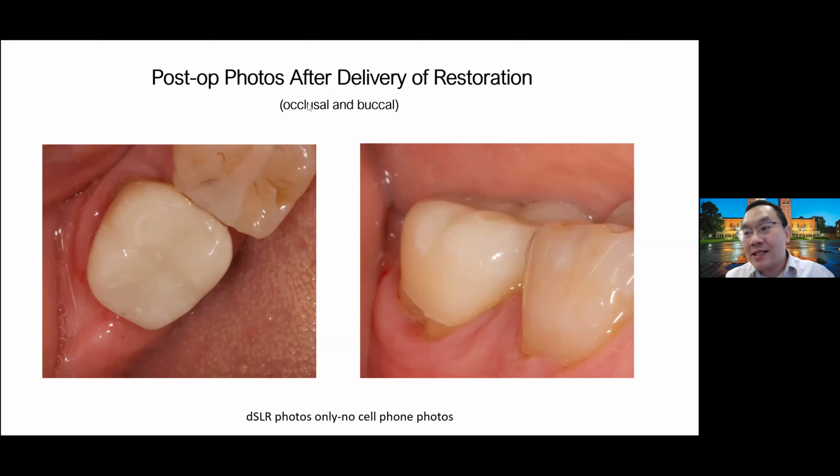So you don't waste that scanner altogether. You can still dedicate it for basically a hygienist every single time they do the exams, an exam check, hygiene check, and they can do a scan for the patient. That still gives you the benefit of seeing the treatment progress and also potentially looking for tooth wear and everything like that, right? Okay. Yeah.